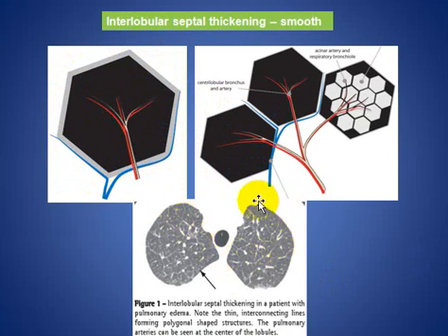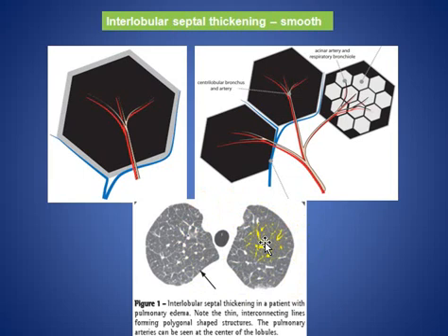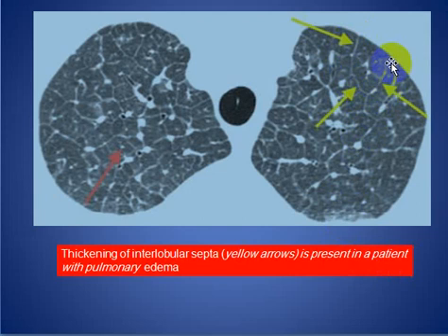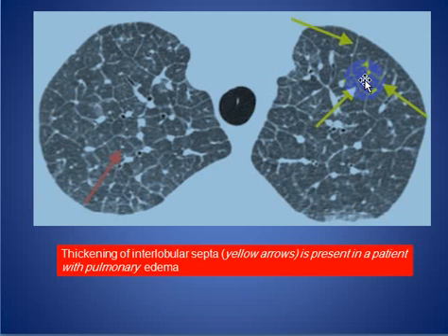Here we see some thickening of the interlobular septum of the secondary pulmonary lobule. The dot represents the central arteriole, and the lucent area represents the central terminal bronchiole.